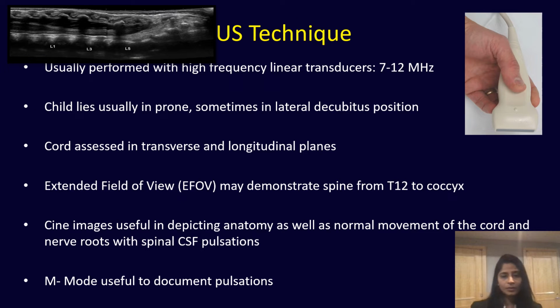Technique is very important in ultrasound. It is warranted that high frequency linear transducers be used to perform the ultrasound, and the cord must be assessed in transverse and longitudinal planes. Additional views such as extended field of view images and M mode might be helpful.